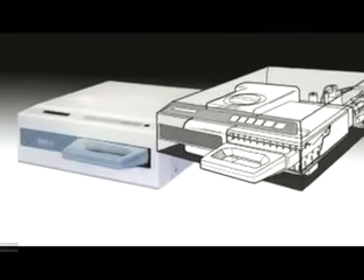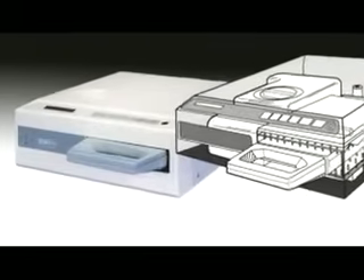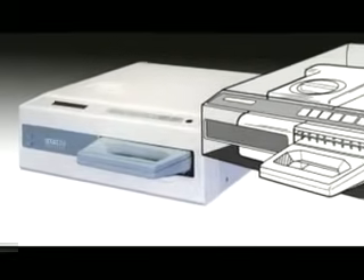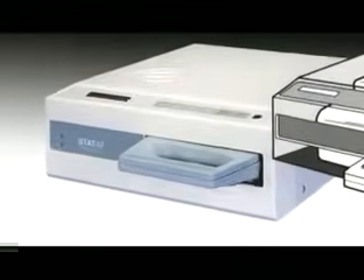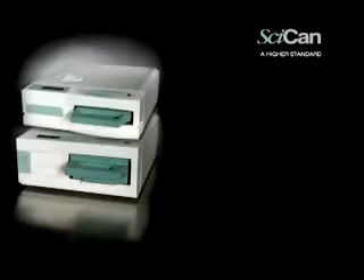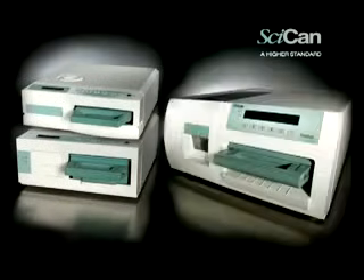The original Statum was the world's first compact sterilization unit designed to meet the need for handpiece sterilization. Now there's a Statum that is perfect for every practice. The Statum 2000, 5000, and 7000 have been designed to provide you with a complete solution for instrument processing — rapid sterilization balanced by rapid drying.